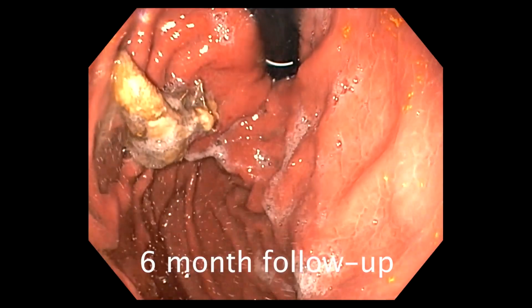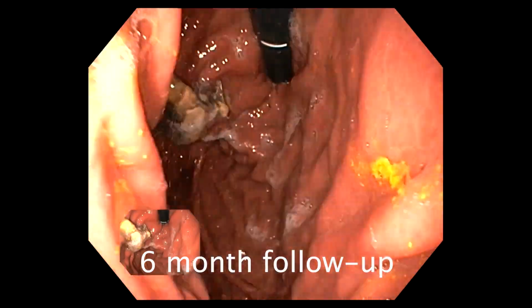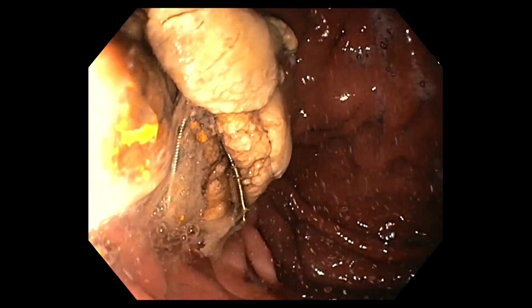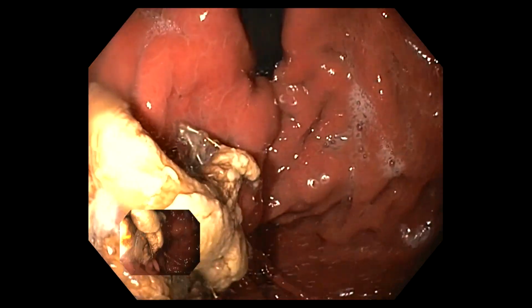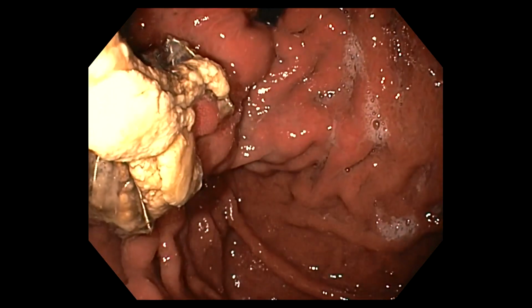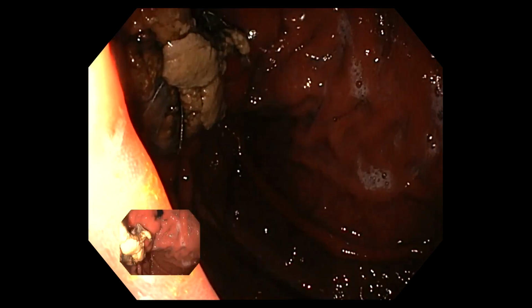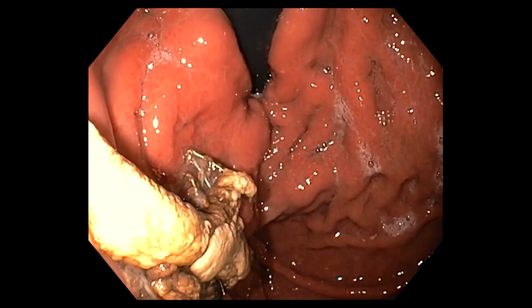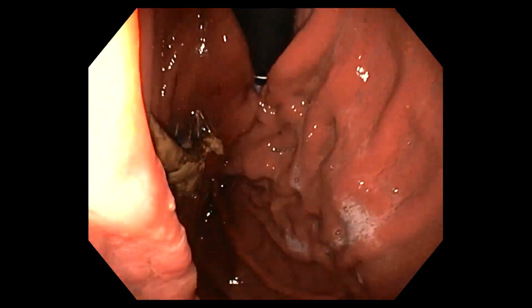Well, you can see the glue coil conglomerate extruding from the fundus. Very nice. And you'll note that the glue is attached to the coil here. See, there's the scaffold. And it really is a nice demonstration of how the coil provides a nidus for attachment of the glue so that it doesn't embolize. I think this is just a beautiful testimony to how the coil really is helpful to minimize the risk of embolization. She has had no further bleeding since her treatment.